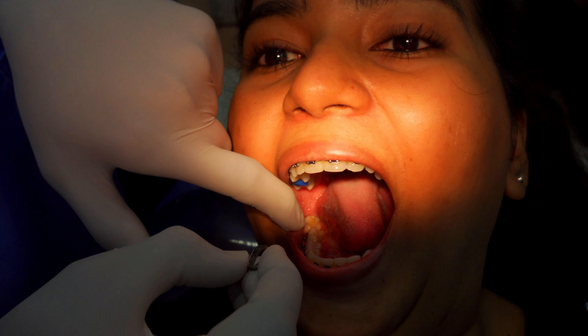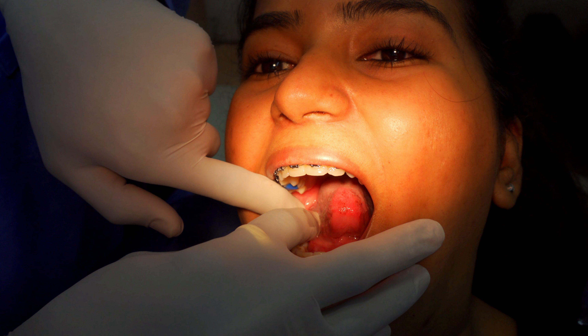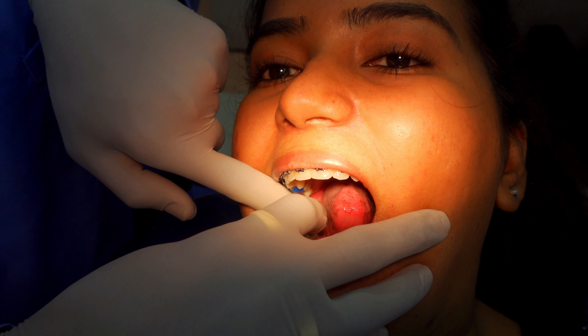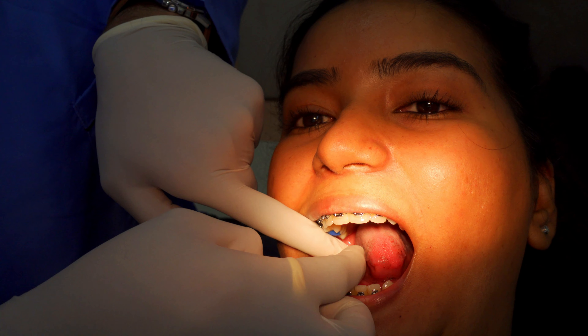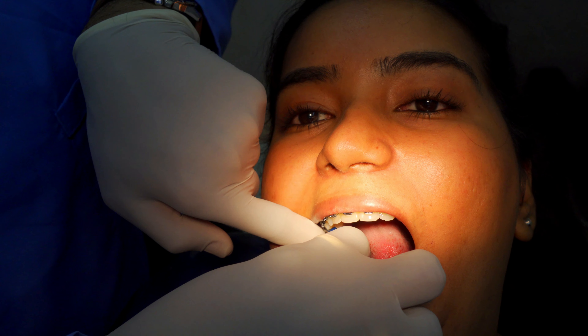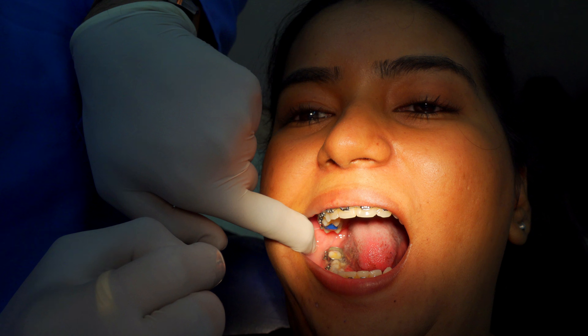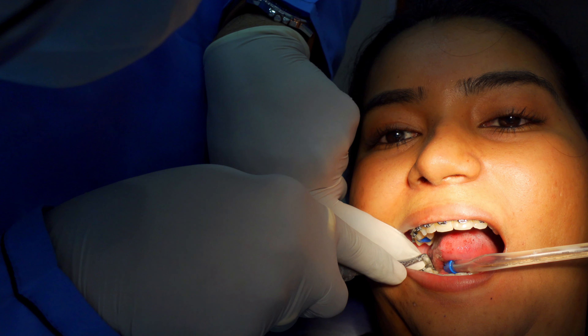Now coming to this molar band, I am always worried about this because this was the most hurtful process of anything else that has been done so far. When they were putting it on the other side, they were checking each of the molar bands and literally pushing it directly into my gums. My gums got sore and they started bleeding. I felt a lot of pain because the gums were hurting and the metal thing was hurting. After trying 3-4 molar bands, he found the perfect match, and he was trying to put it without anesthesia, which was very painful.